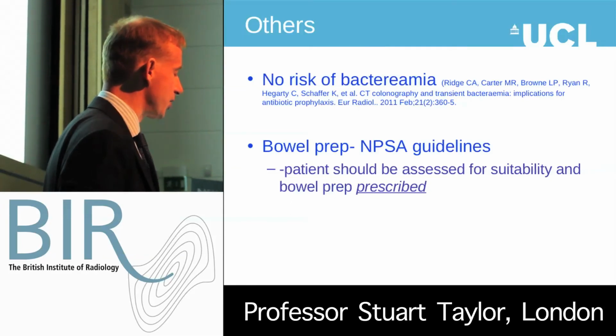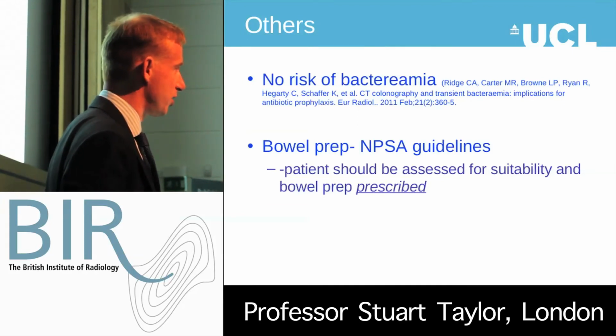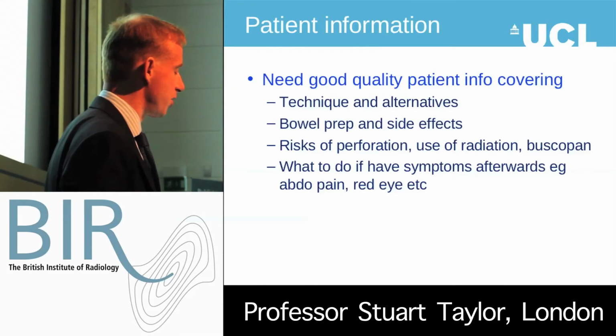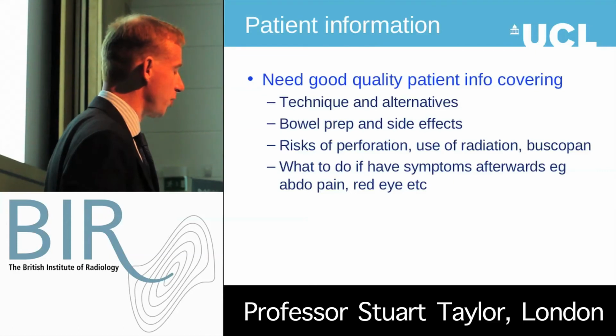I just pick out this one here for the patient factors. We tend to wait about 4 weeks after a deep colonic biopsy before doing CT colonography, because there is a potential to perforate if you do same-day colonography and they've done a deep biopsy in the tumour. If they do superficial biopsies, then we would do same-day CT colonography.